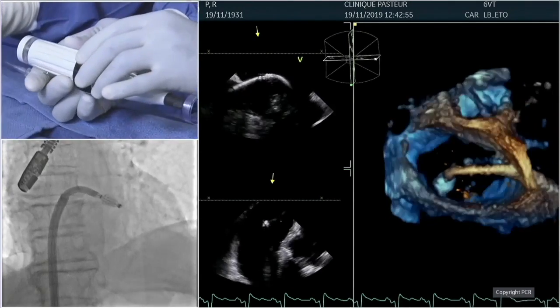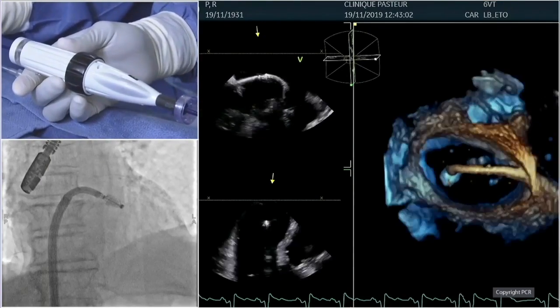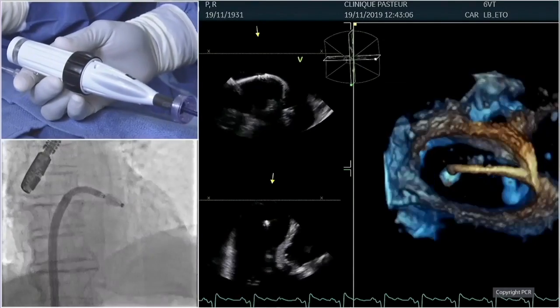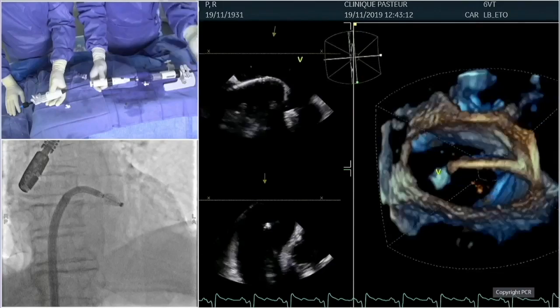Just explain, if you want to go medial or lateral, what option do you have with the system, with the knob and with the pushing and pulling on the system? Can you just explain that? Yeah. So we have several options. We're going to move anterior, posterior, mainly with the guide, making sure that we are parallel. We are happy with that.